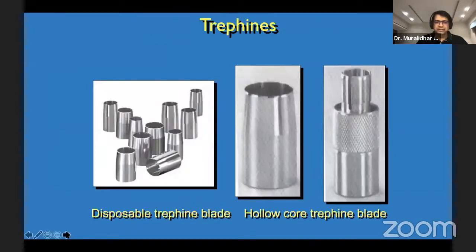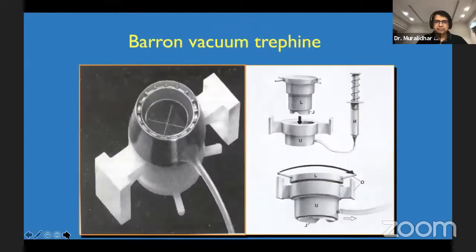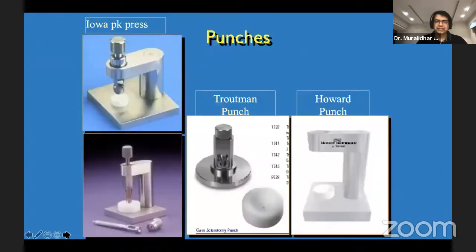And these are the setups, some of the metallic, traditional trephines which have been used for the last century with various modifications. And as I said, the younger surgeons actually prefer the newer variant that gives you much more controlled trephination. It also gives you a big advantage of leaving behind a thin ledge. I'll come to the surgical video. And this also eliminates, at certain times, a decentered or eccentric punching.